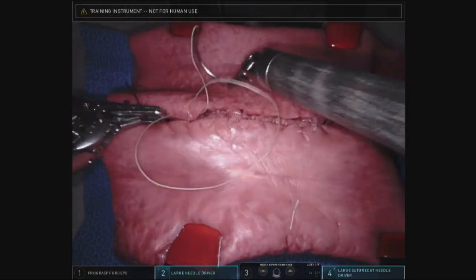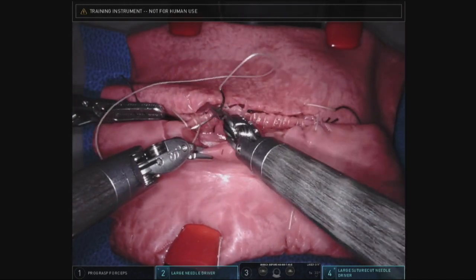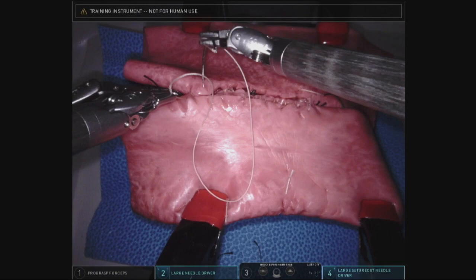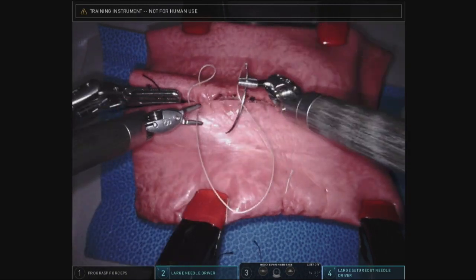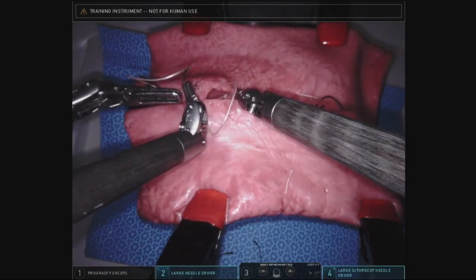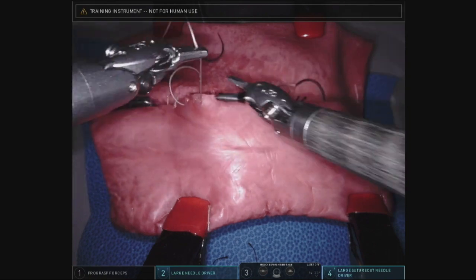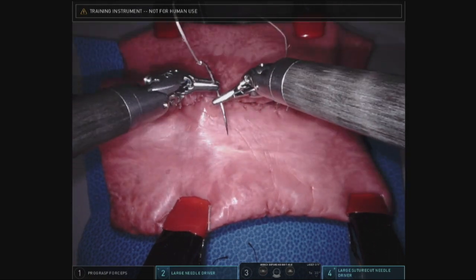As you can see, it is possible to stitch with your left hand when you're using the robot, even though you're right-handed. So once we reach the anterior wall, we will do a Connell stitch. And just make sure you tighten the bowel after each throw so that the mucosa will be inverted.